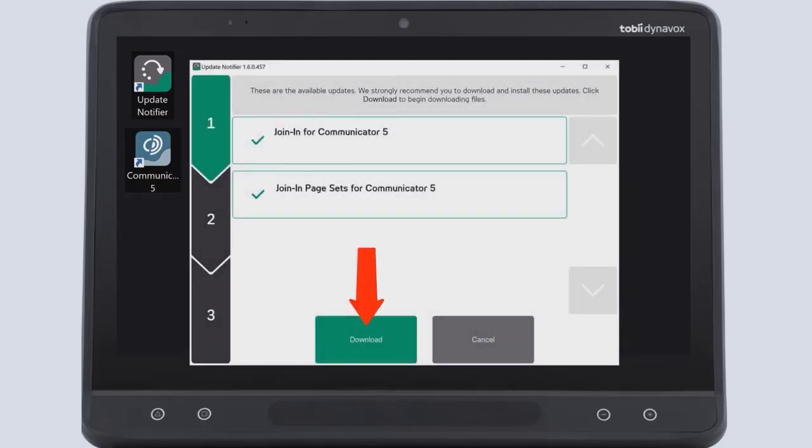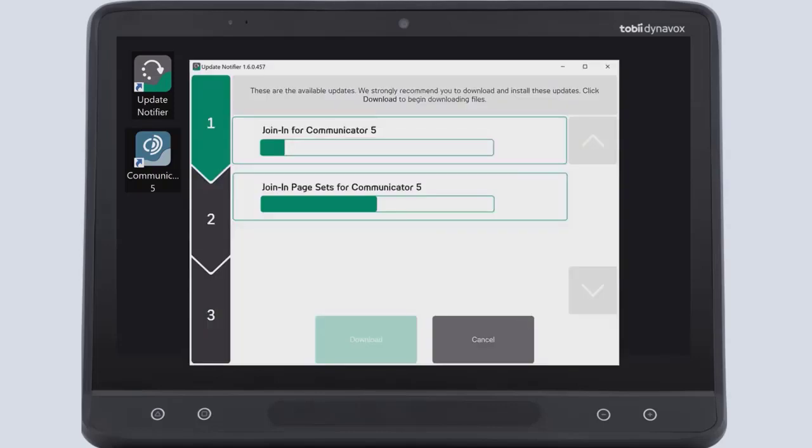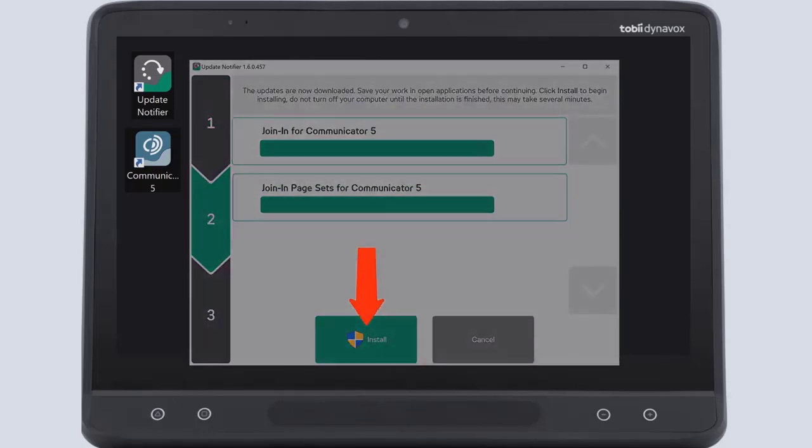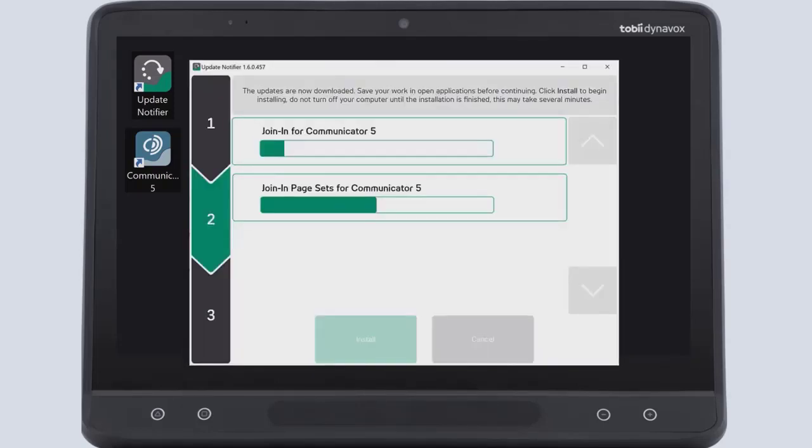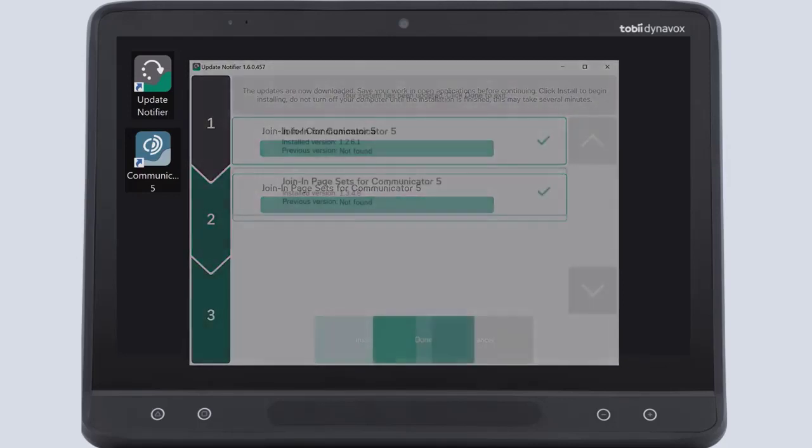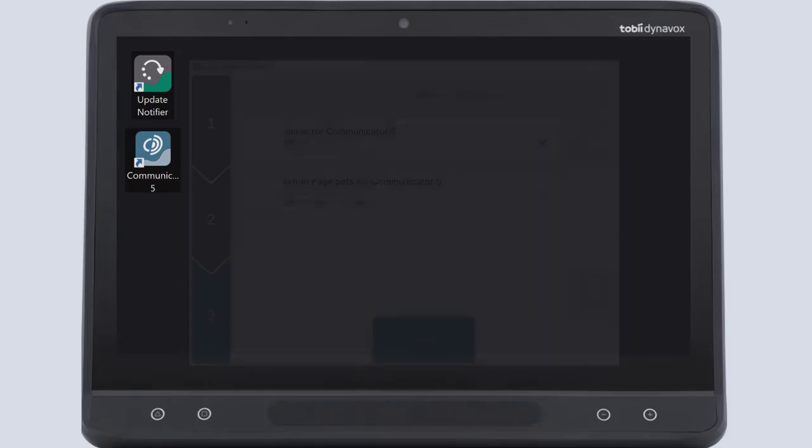Select the Download button. When the updates are downloaded, select the Install button. After the installation is completed, select Done and exit the Update Notifier.